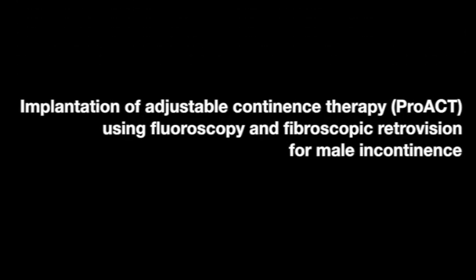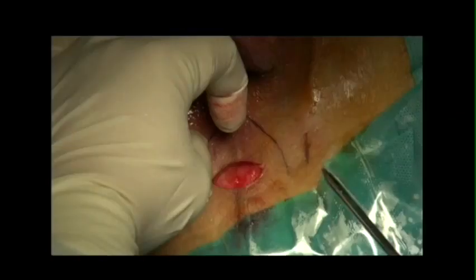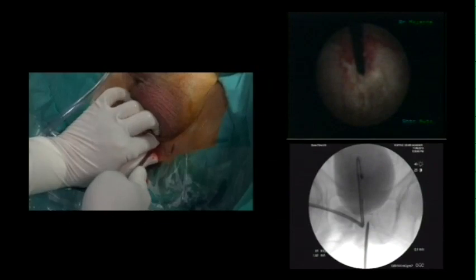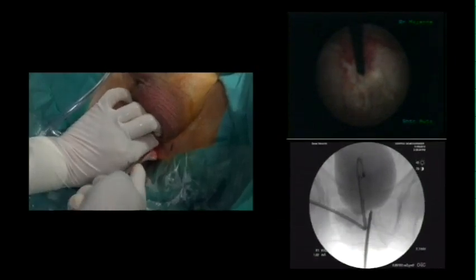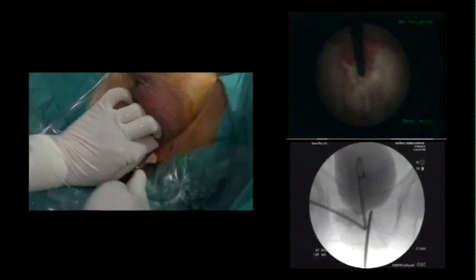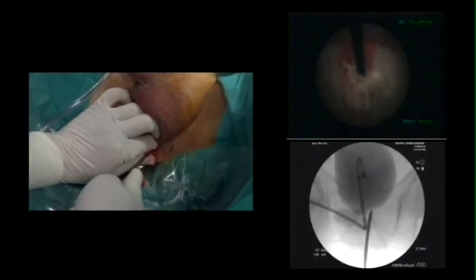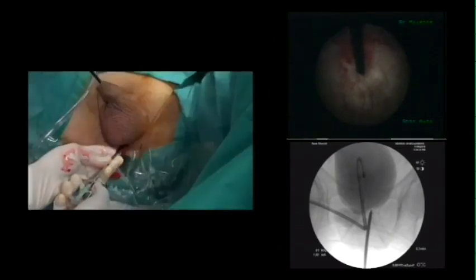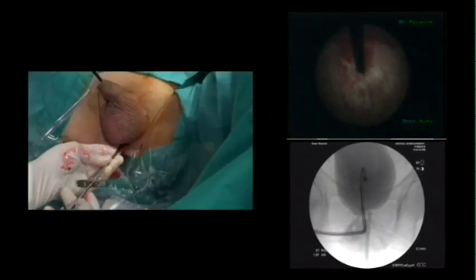Implantation of adjustable continence therapy using fluoroscopy and fibroscopic retrovision for male incontinence. The trocar is introduced through the perineal incision under fluoroscopic imaging and fibroscopic control, then moves parallel to the urethra until it elevates the trigone.